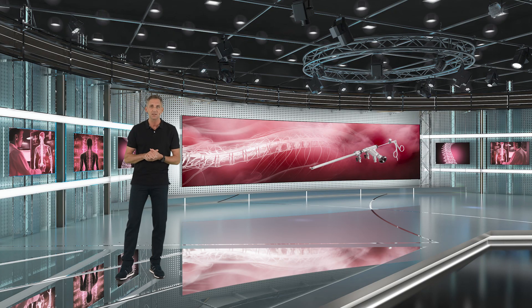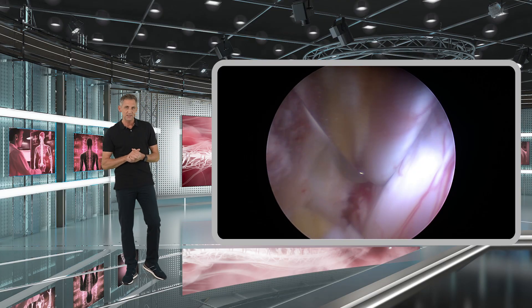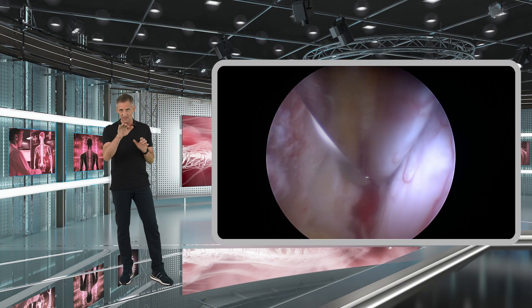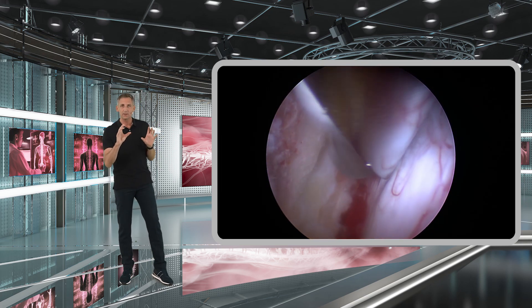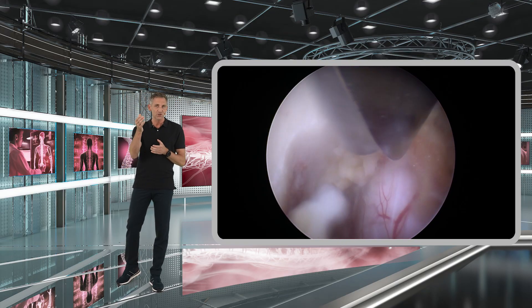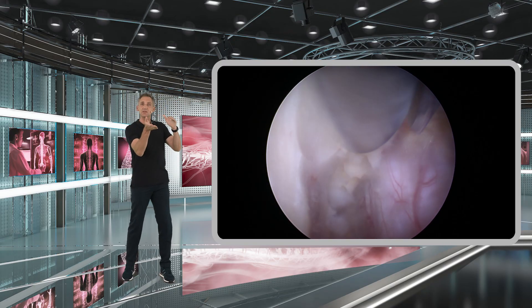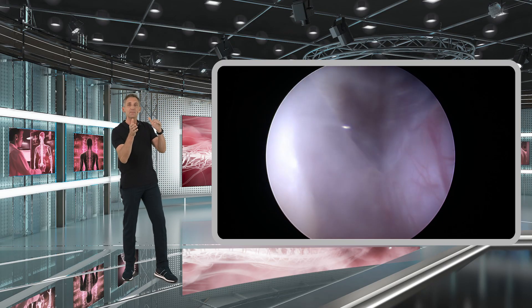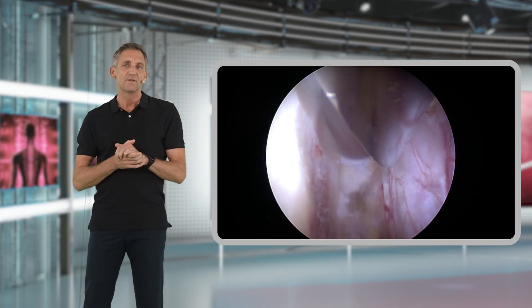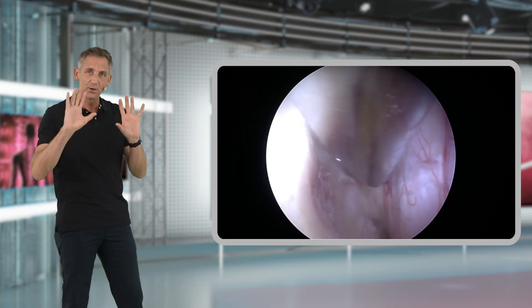Depending on intraoperative circumstances, you may have to extend the contralateral bony recess decompression using the high-speed burr. In this area we are working in very close proximity to the neural structures with our sharp burrs. Make sure by turning the endoscope that you can see the sharp side of the high-speed burr at all times and that it is not in contact with the neural structures. The back shield of the burr should safely protect the dura.